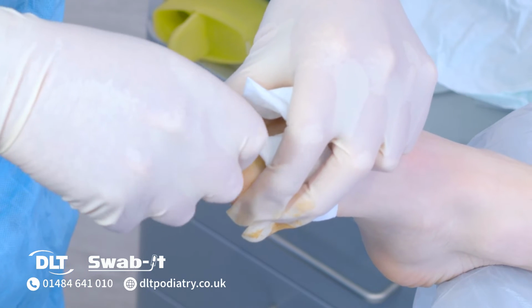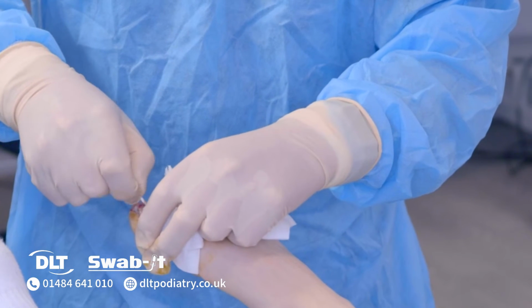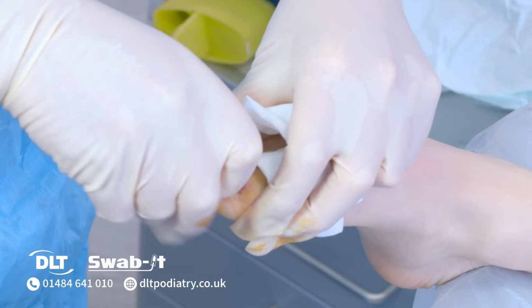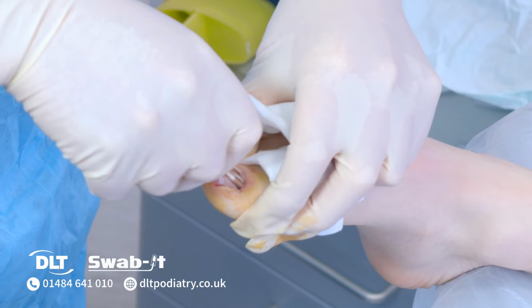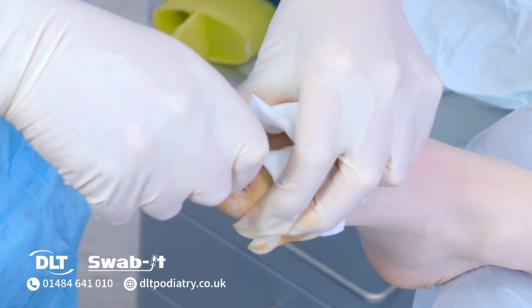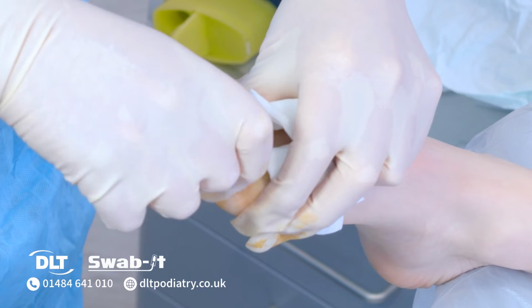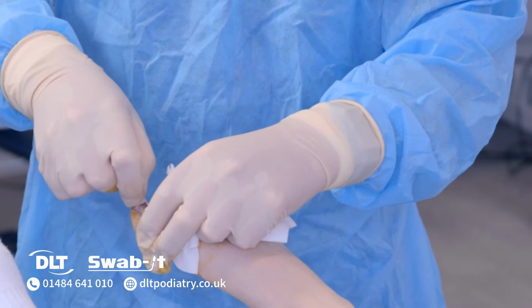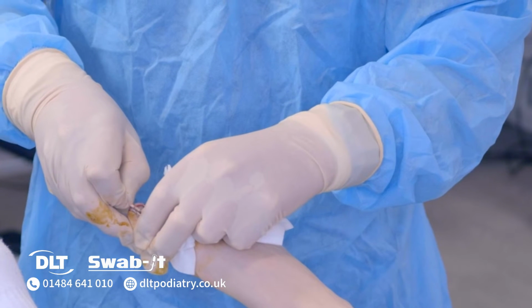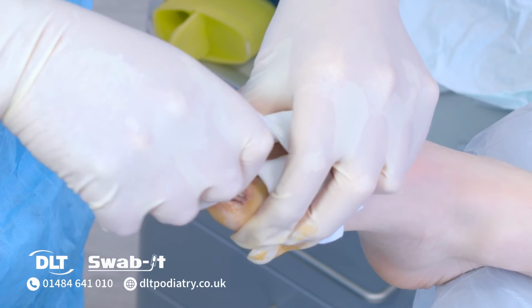If you angle the Swab-It, you can see how it's pressed against the nail bed, that the phenol is released from the swab. If you don't rotate, a lot of the phenol will stay within the swab. You can use some abrasive action, which is recommended from the literature, because that helps to ensure that the phenol is absorbed into the nail matrix.